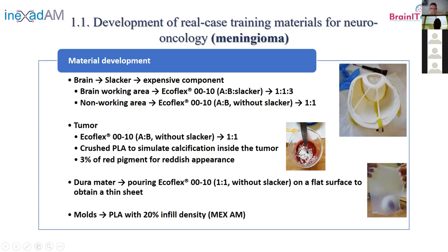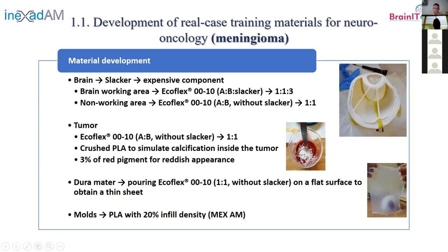Around the brain we have the duramater — the meninges. To produce that, we poured some silicone on a flat surface and obtained a thin sheet that we placed over the brain. We did the molds using 3D printing with material extrusion in PLA. The general process was: start with CT images, perform segmentation in 3D Slicer software, obtain the 3D STL model, do CAD design features, obtain the final STL, 3D print it, and produce the final synthetic models by pouring the silicones.